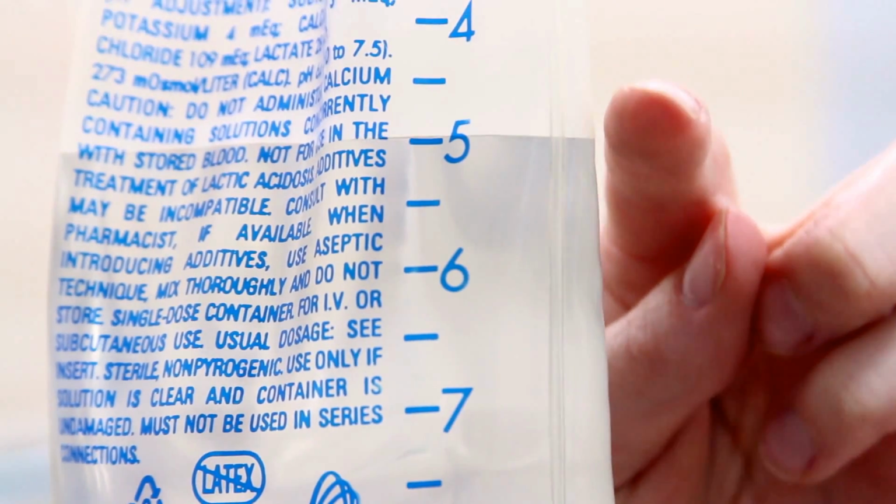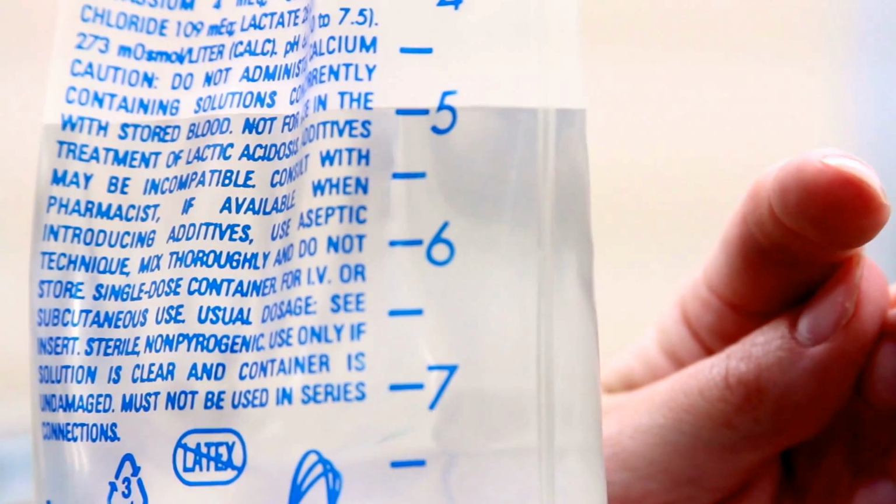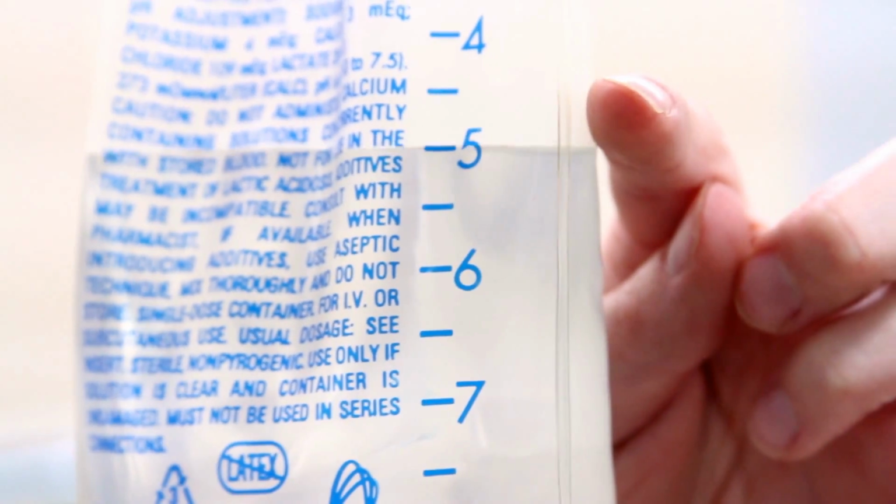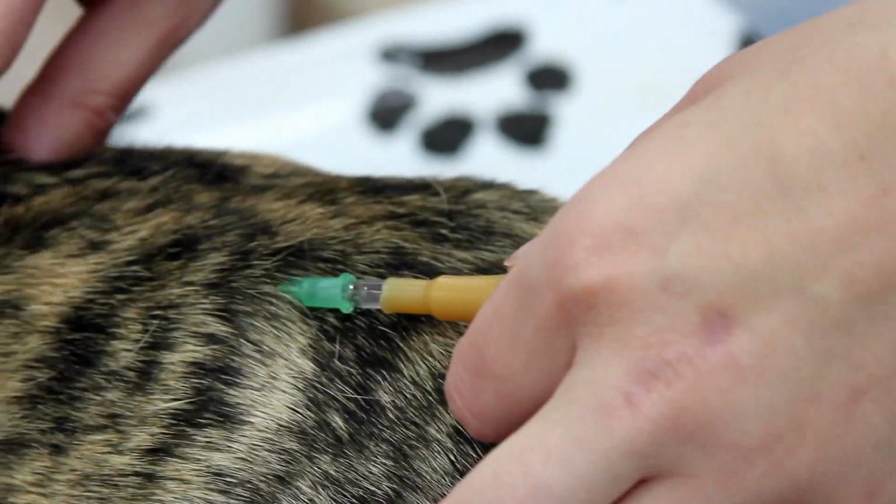As you see on this bag here, we're starting at the 5. Each one of the lines that has a number next to it is going to be 100 ml. So if we were giving her 100, we would go from the 5 to the 6. And that's where we would stop our fluids.